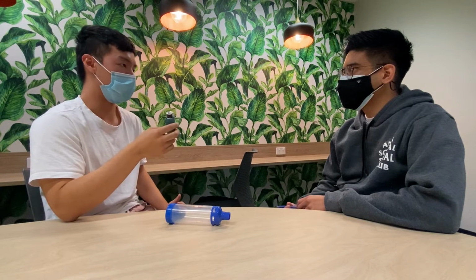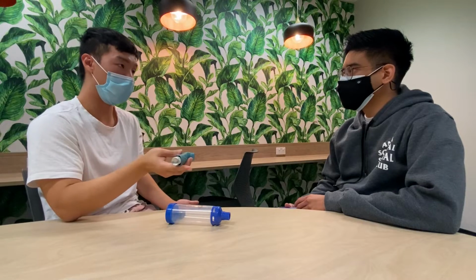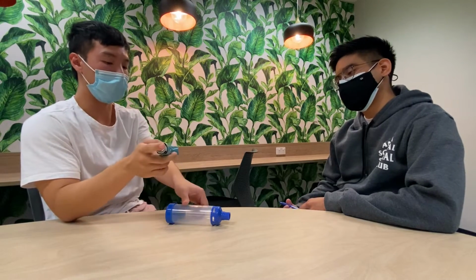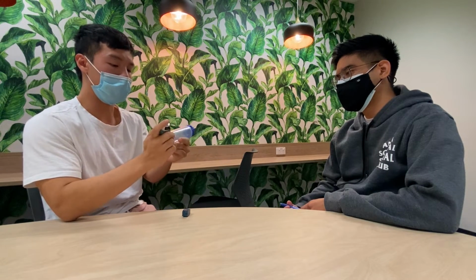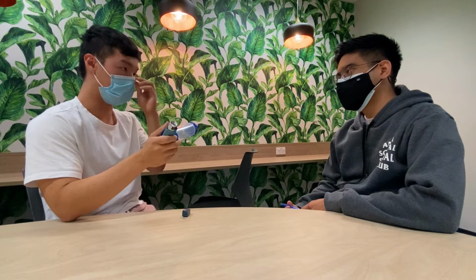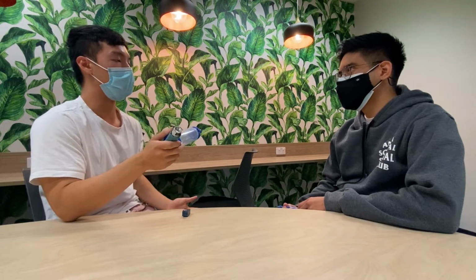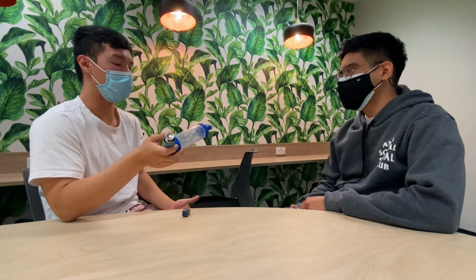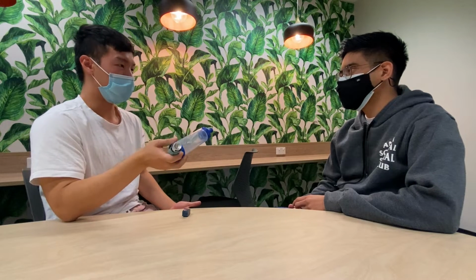Depending on your recommendations, it's either 2 puffs or sometimes even more, at a certain time during the day, and we recommend also using the spacer. Now, because the preventer is a steroid, it can increase the risk of infections. So we recommend rinsing your mouth quite thoroughly after you use the preventer each time that you do it. Yep. Yep. Does that make sense as well?